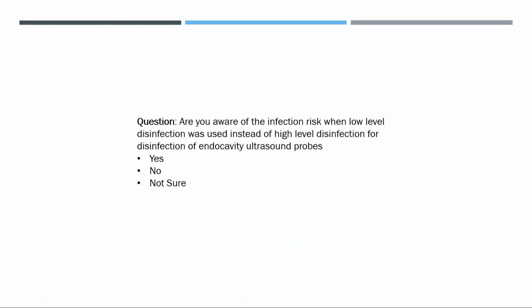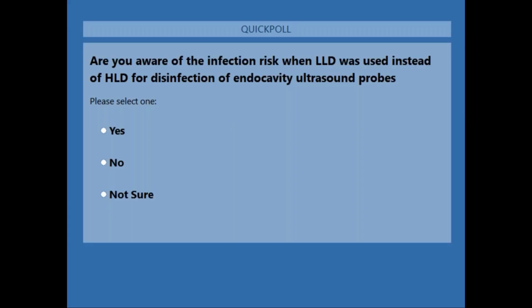So another question for you. Are you aware of the infection risk when low-level disinfection was used instead of high-level disinfection for disinfection of endocavity ultrasound probes? And I should say by endocavity probes, I just want to be exactly clear. We're talking about probes that would enter, say, the esophagus, such as for transesophageal echocardiography, or enter the vagina or rectum for ultrasound of internal body organs. So again, please select one of the following: yes, no, or not sure, and we'll give you some time to answer that question.